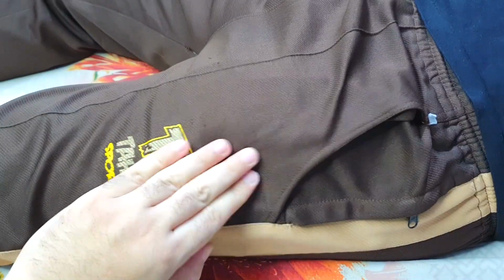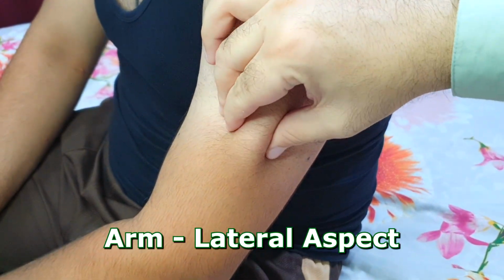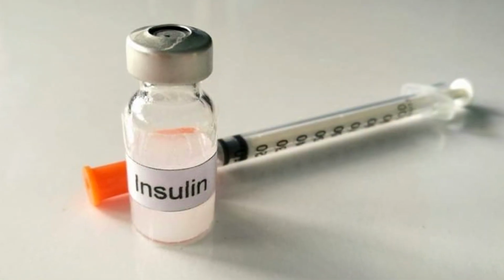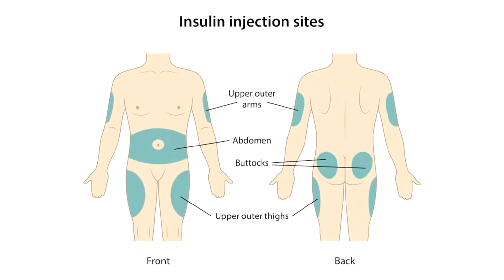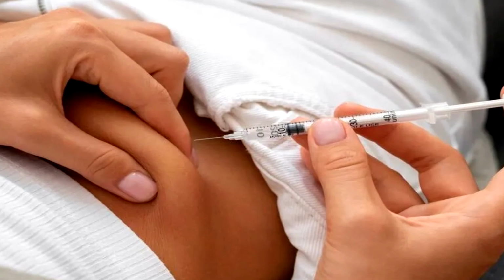Apart from the abdomen, you can pinch the anterior thigh skin and administer the subcutaneous injection there. Other sites that can be chosen are lateral aspect of the arm or posterior aspect of the arm. For those who regularly use insulin injections, make sure to rotate injection sites to prevent complications like changes in fat tissue causing lumps or dents under the skin.